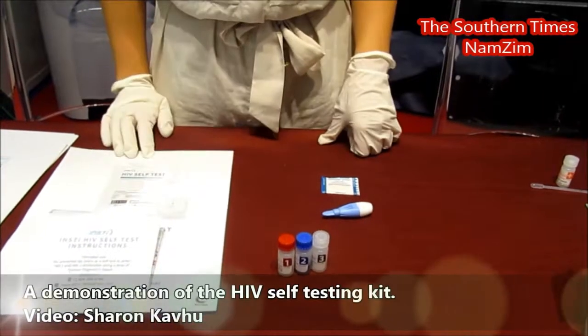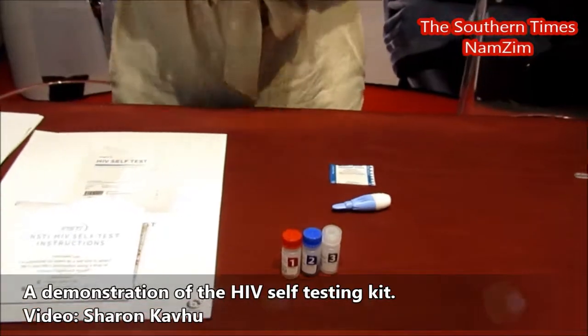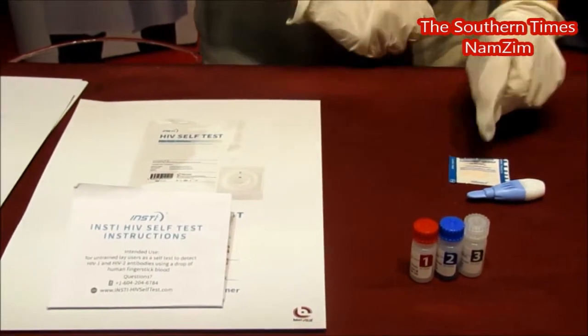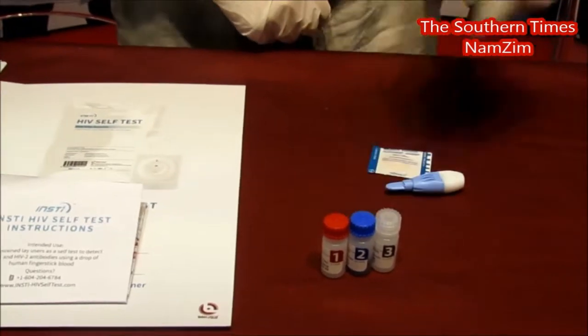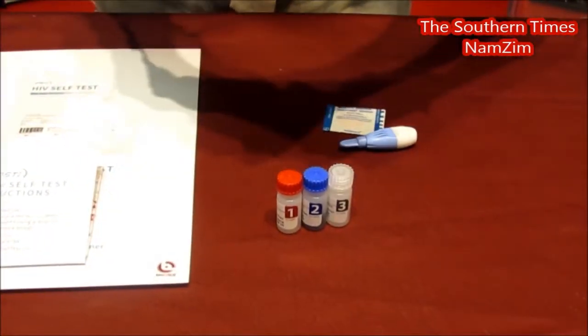Today I will be demonstrating the INSTI HIV self-test. It comes in a package with your instructions, a lancet, a band-aid, your three bottles, as well as the membrane unit, which we have here.